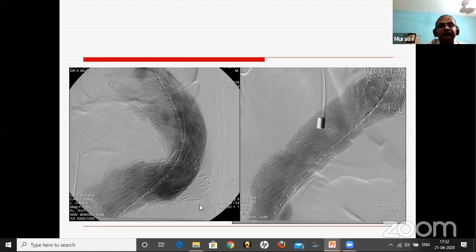number one is, you look at the CT scan very carefully. Most of your endovascular work is done in your CT room. It's more of a mental game. Look at all the measurements, take time, analyze yourself on the workstation. If you can do it in the CT room, it is okay.